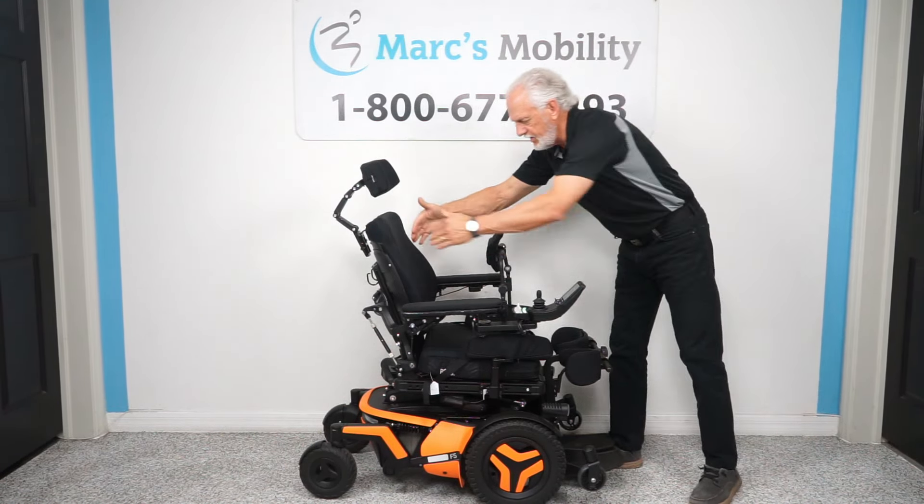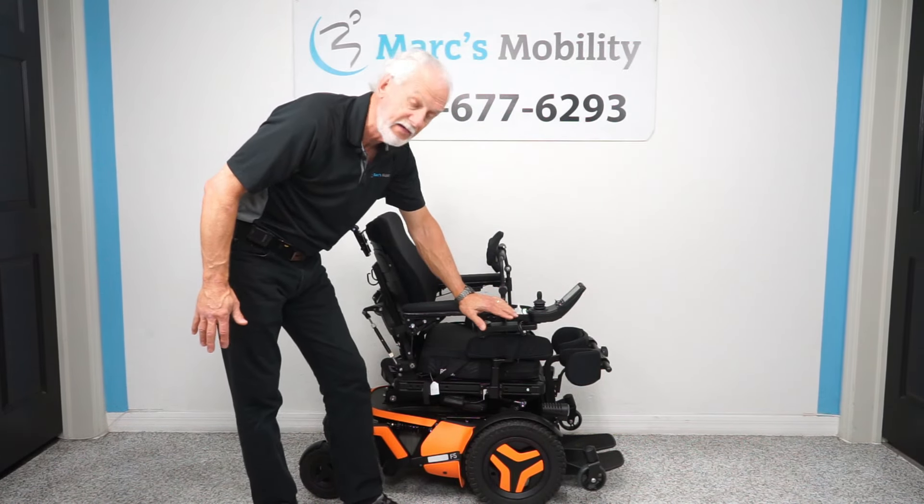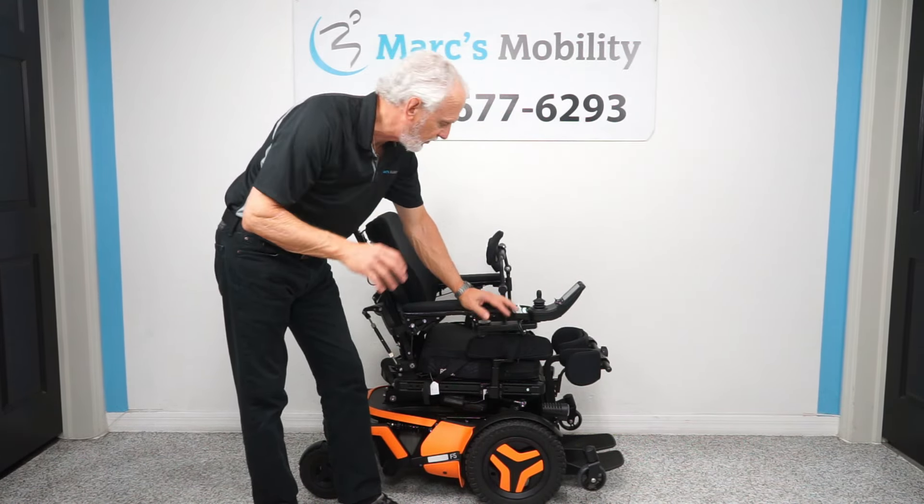Once you've got the knee brace and the chest bar adjusted for your loved one, you can do all the functions through the joystick or through this little box right here — I like to use this box, it's a little quicker. If I push the first button, you'll see the seat starts moving up, the legs go out, and you will see these wheels go to the ground right here when the seat starts going up. The seat will go all the way up, and the nice thing is you can still drive this chair at a reduced speed.